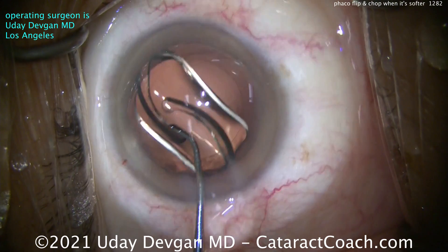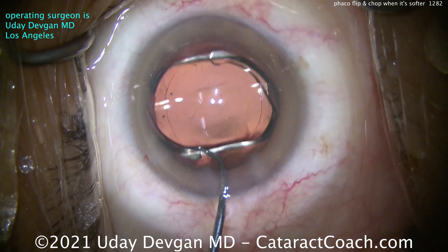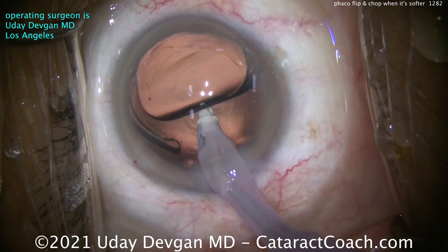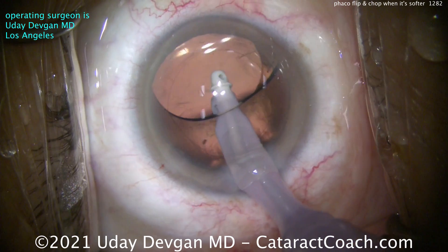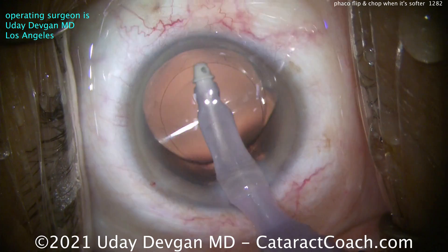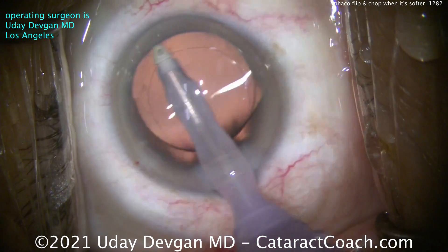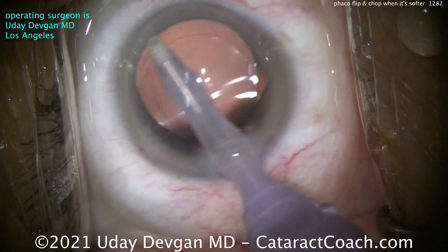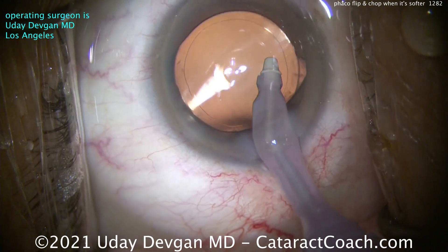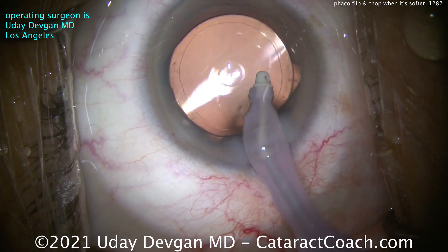The key in the whole FACO flip case: number one, getting a good-sized rhexis — you can't have a baby rhexis. We all know about the curse of the baby rhexis. Number two is consistency on the hydrodissection. There's a video on CataractCoach.com showing exactly how much force I use on that BSS cannula — a 3cc syringe with a 27-gauge blunt cannula. That video shows you outside the eye how much of a squirting arc you achieve, so you can judge and practice in your own OR. This rhexis looks about 5.0mm — a little smaller than the previous case, where the denser cataract had about 5.5mm.